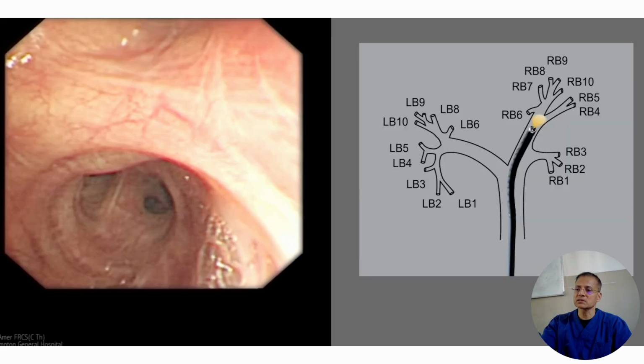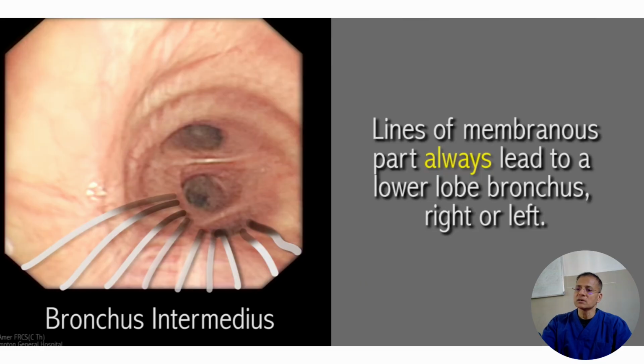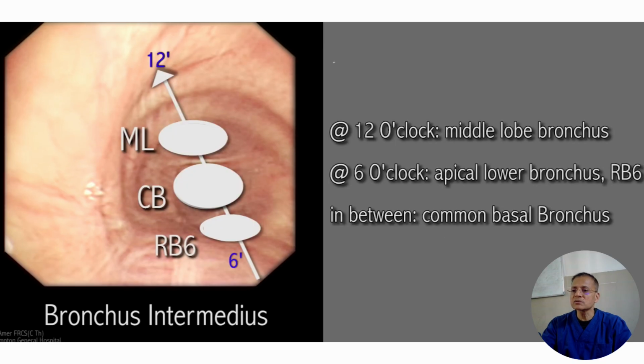This is the inlet, that is the outlet, shown here. Now we're moving further down. Then we'll visualize, and it's always true that this membranous part is very posterior. So one point of difference is where the anterior portion is and where the posterior portion is. The landmark will be that the membranous part or strip suggests the posterior part, and the cartilage part is the anterior.